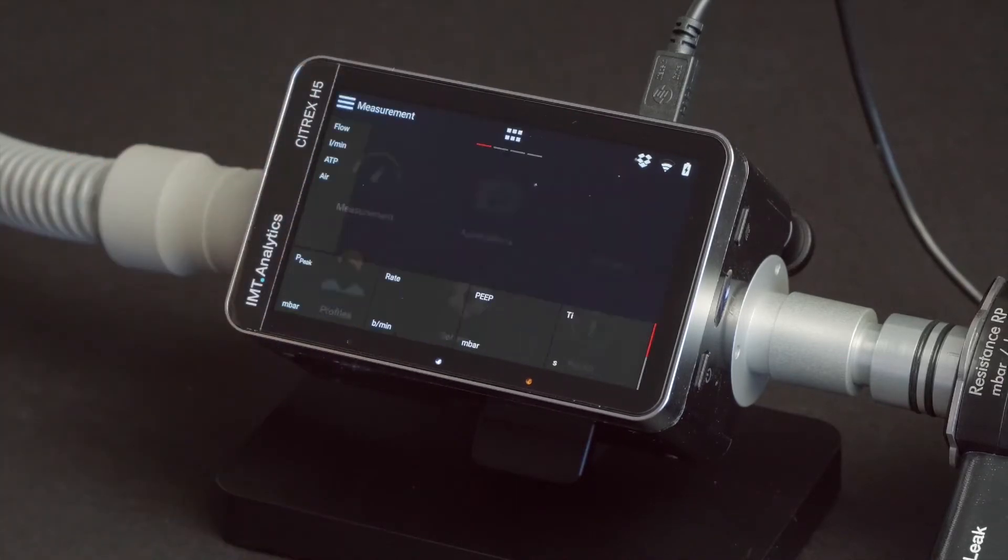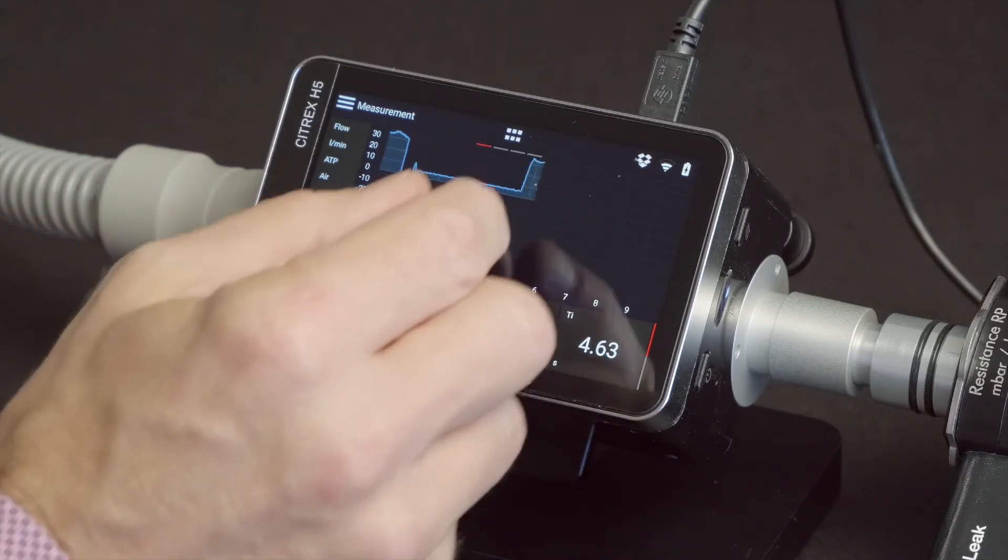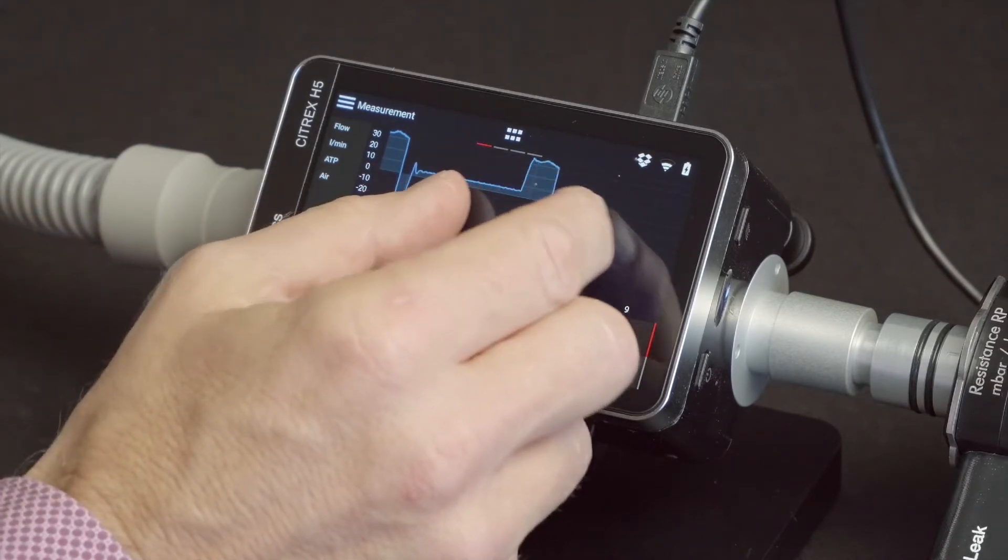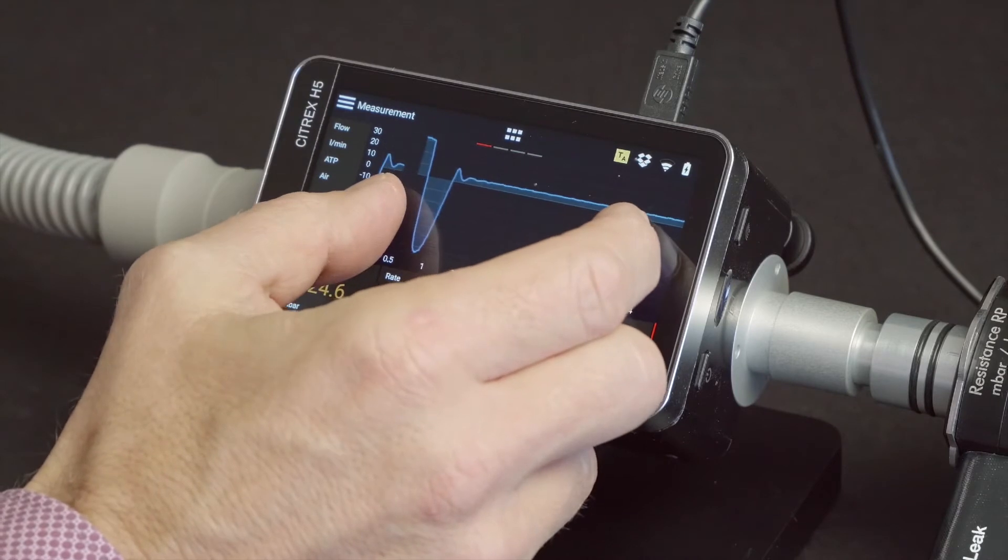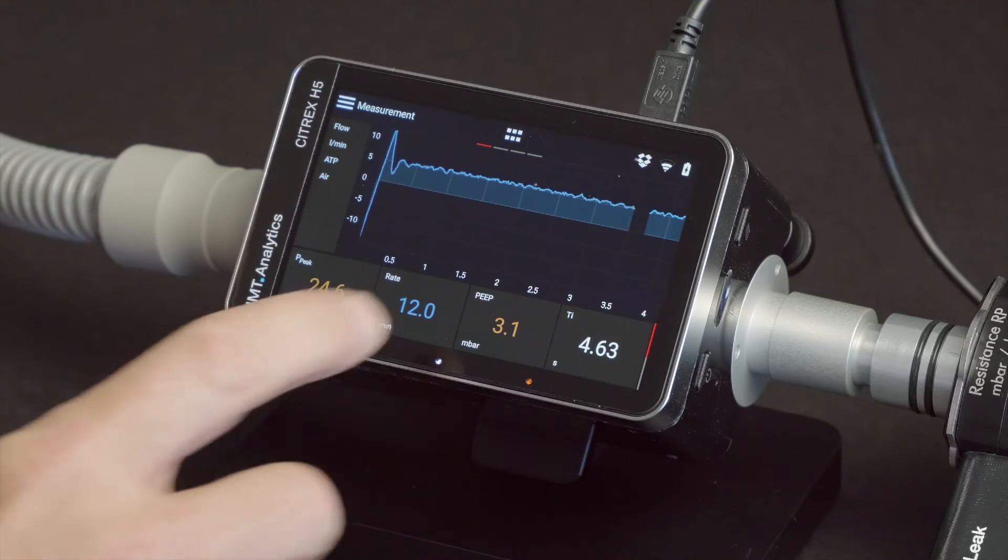On the large screen, you can display real-time curves and measure values in high resolution. For zoom in or out on measurement curves, move the thumb and index finger together or move them apart.